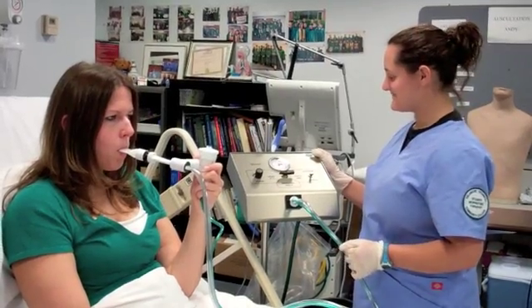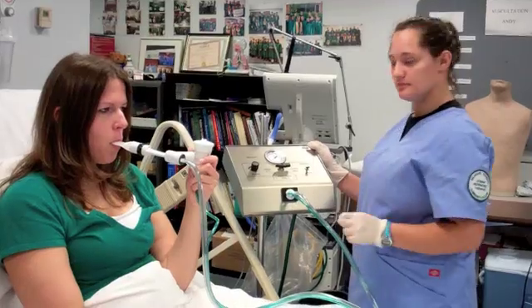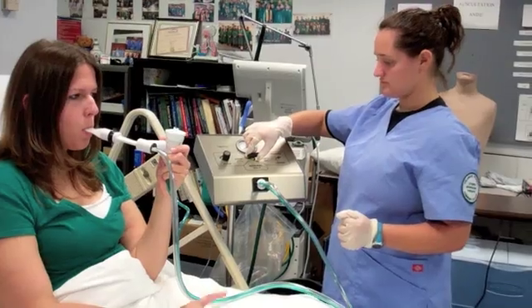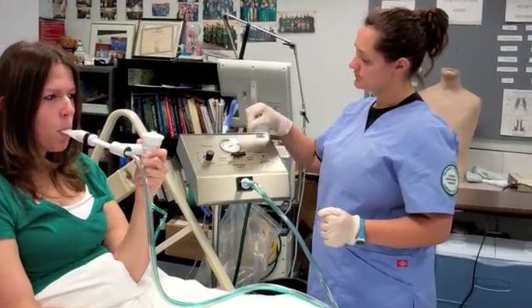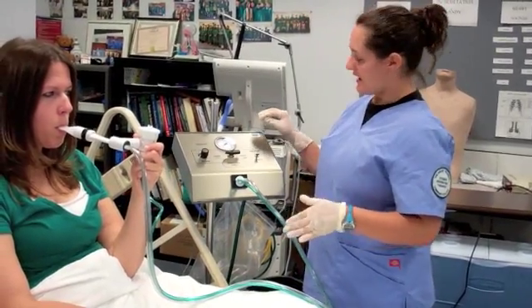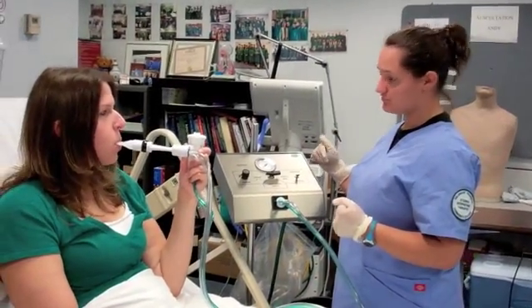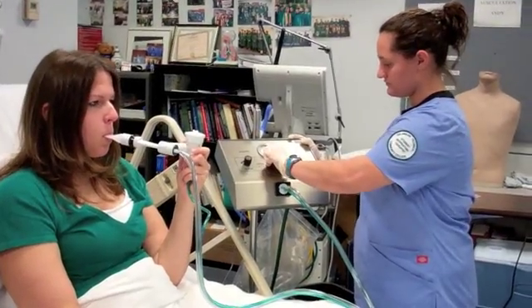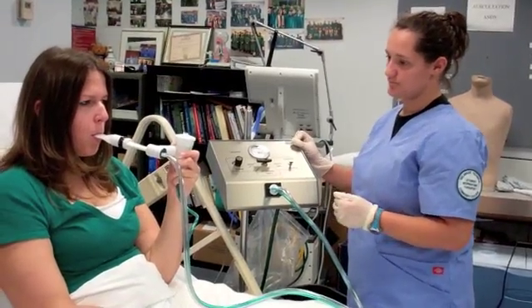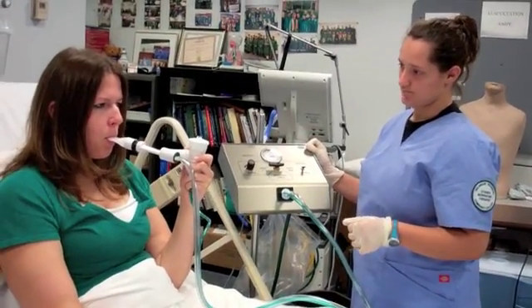If the patient is consistently getting above 10, you may want to turn it up to where the patient is comfortable and still able to tolerate it. After a few minutes on the CPAP mode, switch to the high-frequency mode. Before switching, tell the patient to keep breathing as normally as they can: 'I am going to change it to high frequency. It is going to sound and feel like a choo choo choo. Continue breathing normally — don't try to keep up with the machine.' Due to the alternating frequency of the air, sometimes patients will change their breathing pattern to match the machine, which you do not want to happen. It may help to associate it with a choo choo train so they know what to expect.